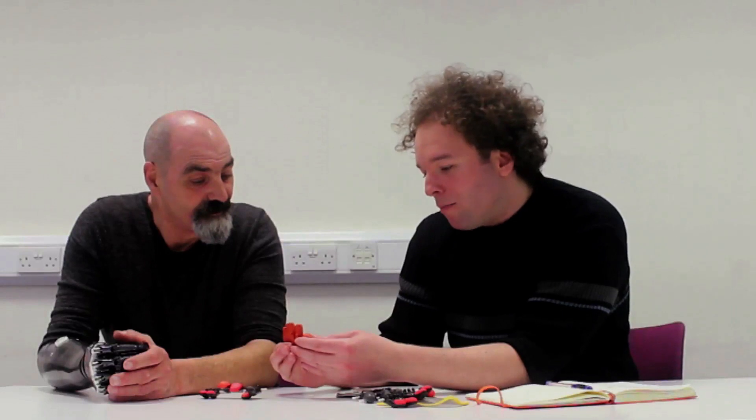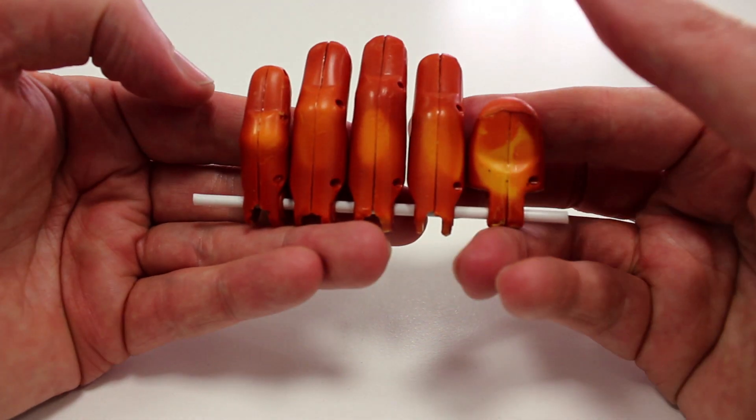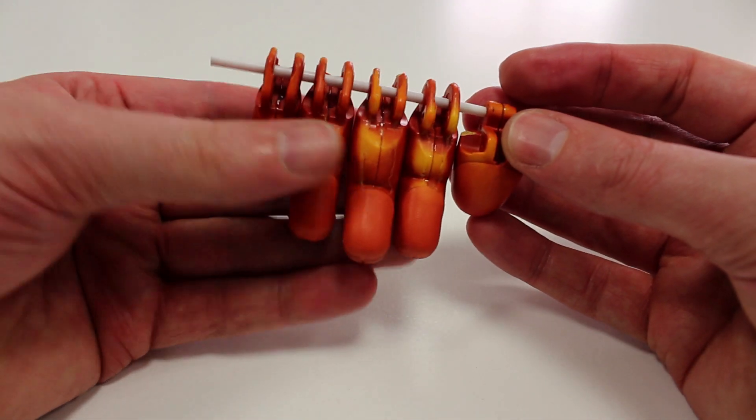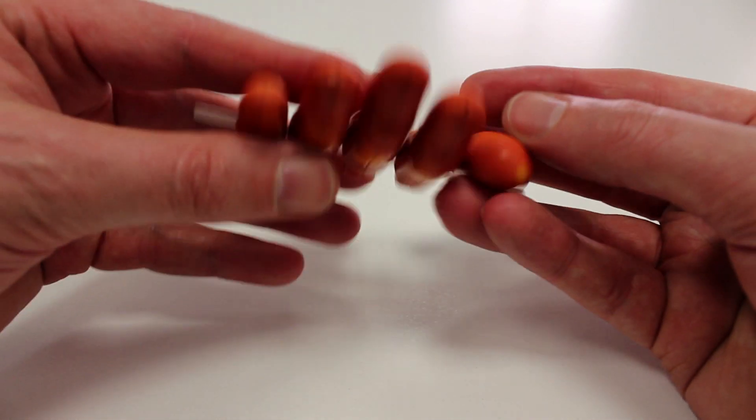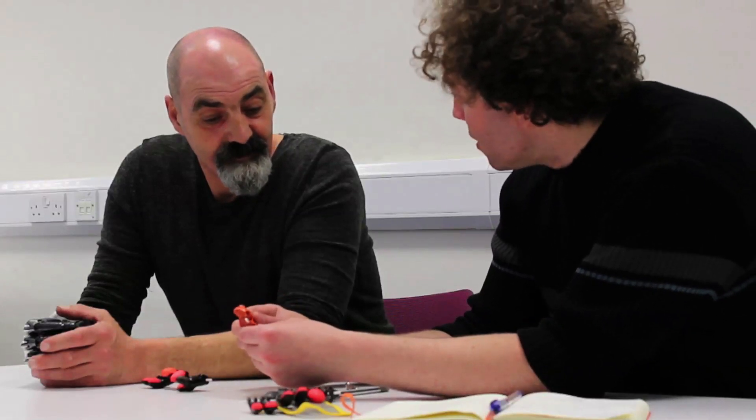I thought: obviously you have a hand that can sense temperature, but what about when you didn't want to use that hand because it was maybe dangerous or painful? Maybe it could detect extreme cold or extreme heat. If this was made out of something that melted at, say, 120 degrees, this would change color at 100 to warn you. That way you're not going to put your hand into the barbecue.